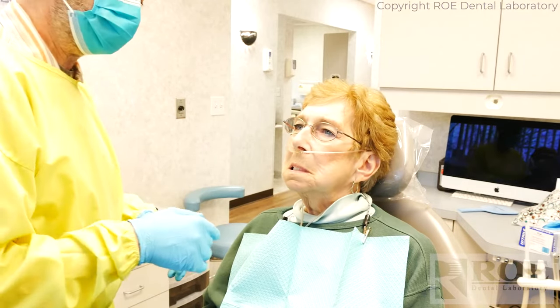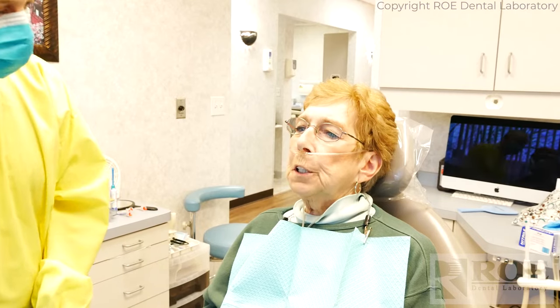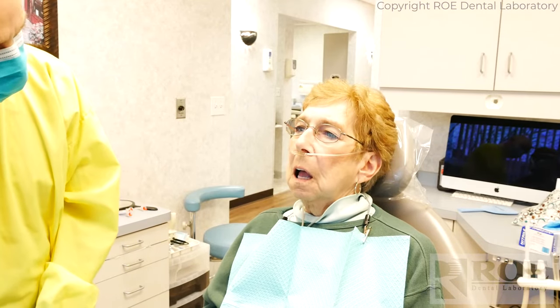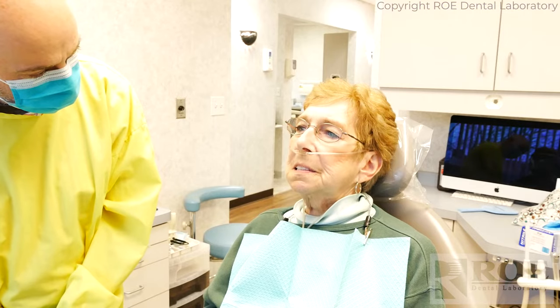Most patients have a hard time doing both — you did great. It's harder to go towards you, isn't that strange? Can you say 44 for me? 44. You did great. 55. 55. 85. 85. 94. 94. 98. 98. 94. 94. 97. 97.